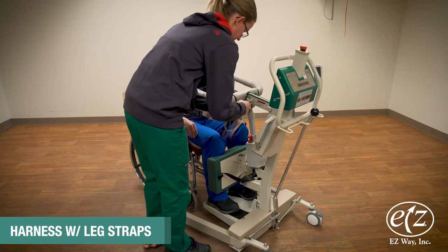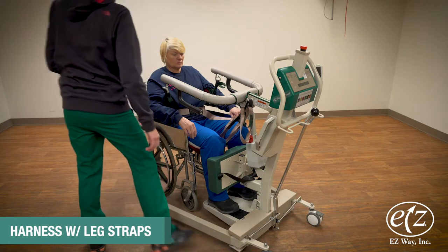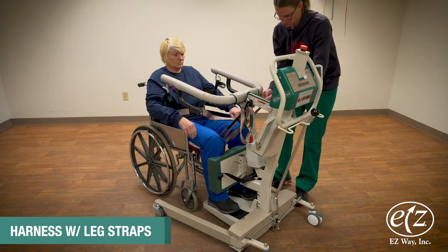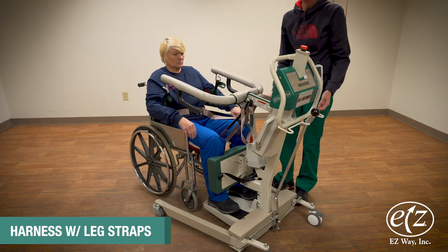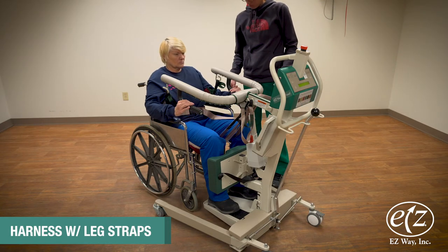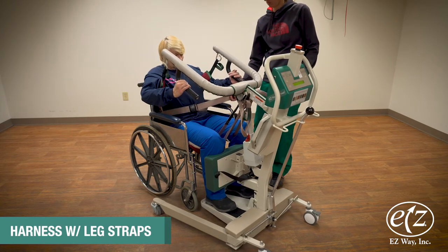Then hook each leg strap up to the two small hooks located on the neck of the Y shape that forms the base of the easy stand arms. Use whichever loop strap is reachable — you do not have to cross the straps in front. Make sure that the loops are securely placed in the hooks before you engage the motor.